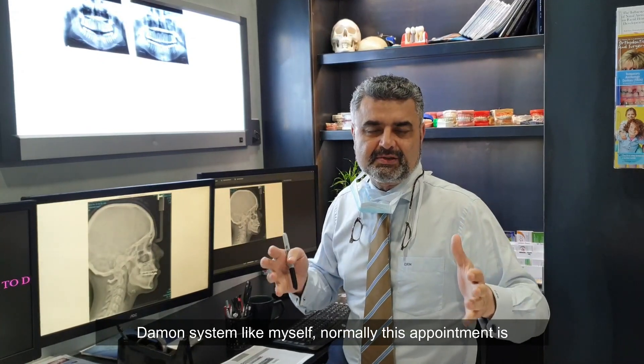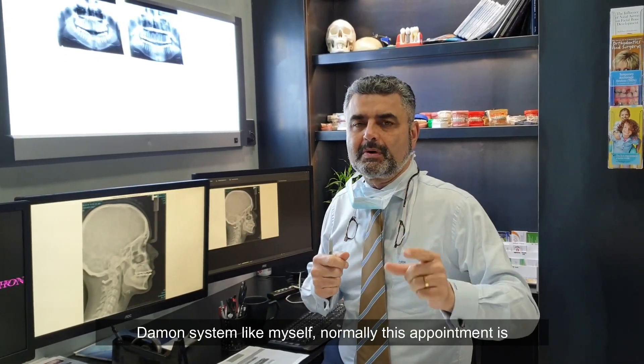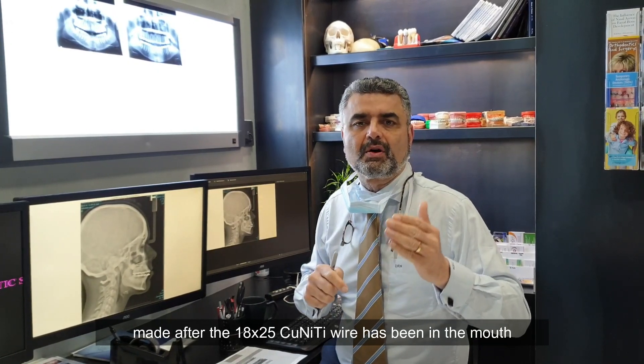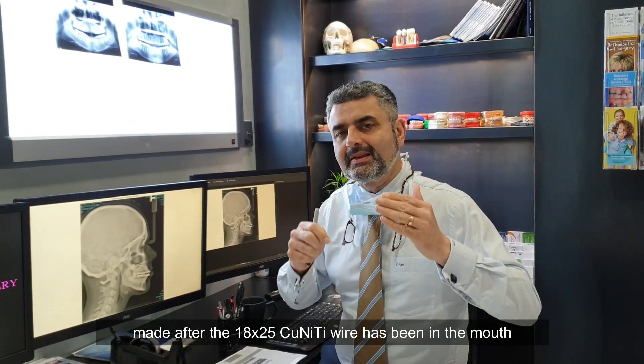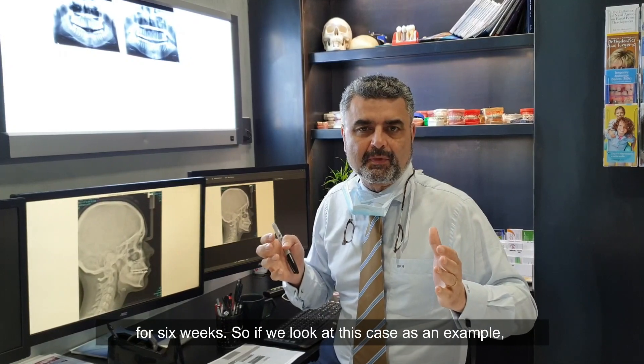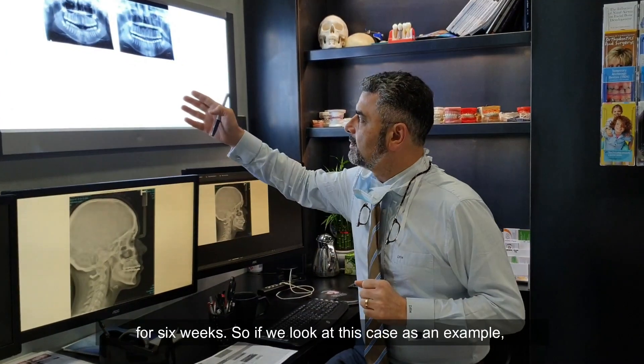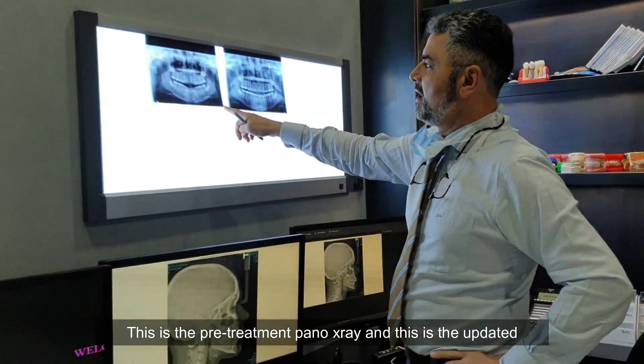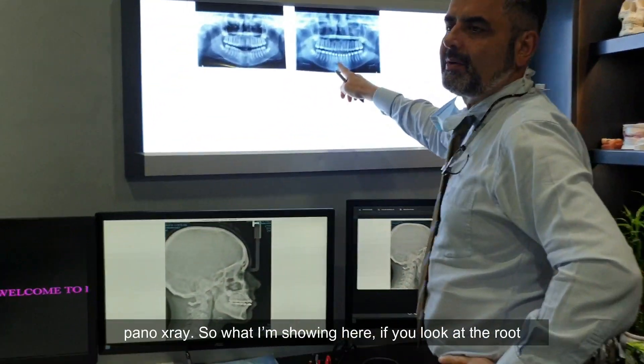For those doing the Damon system, like myself, normally this appointment is made after the 1825 copper niti wire has been in the mouth for six weeks. So if we look at this case as an example, this is the pre-treatment panorex, and this is the updated panorex.